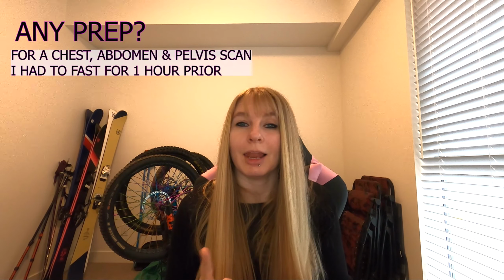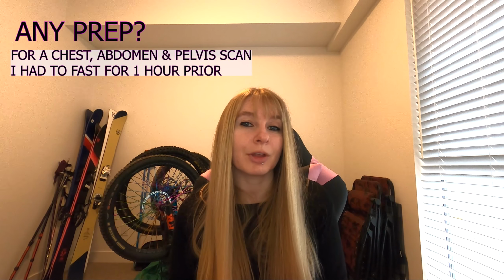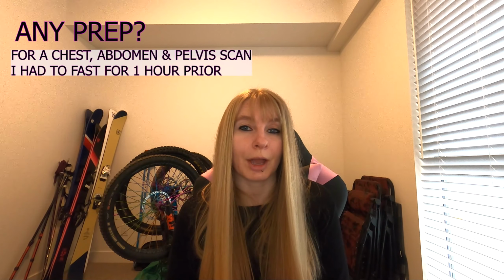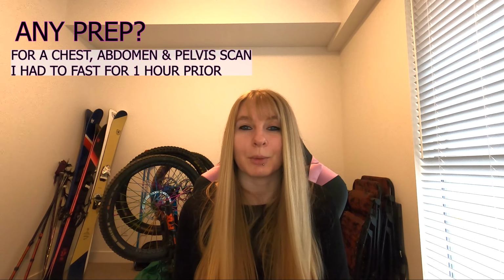So is there any preparation for a CT? Possibly. It will depend on the scan that you're having. Last time, as I was getting my chest, abdomen and pelvis scanned, I was told that I had to fast for at least 1 hour before my scan. So that meant that I couldn't eat or drink anything for at least that 1 hour before I was booked in. When I had my head scanned before, obviously that wasn't an issue.